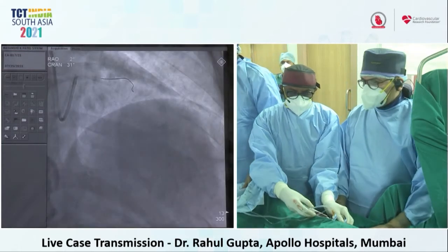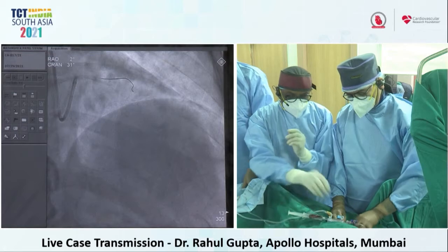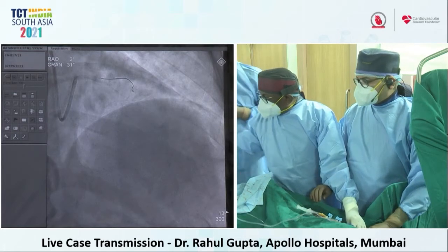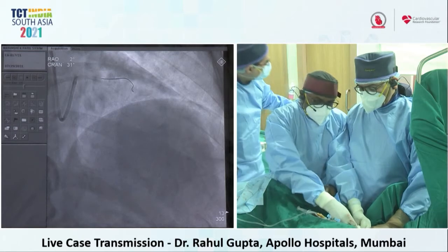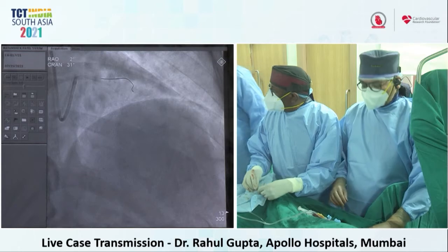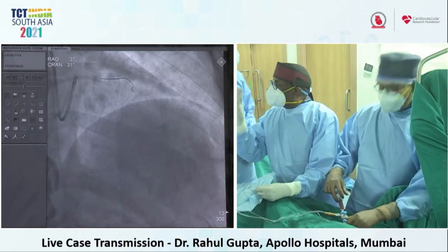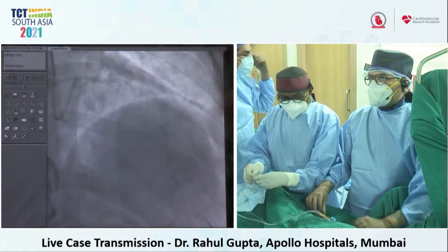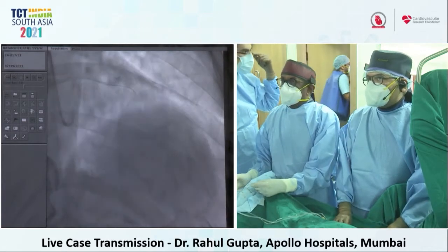Yeah, so the two comments I had was, one is that the radial artery size, Dr. Atul actually quoted for Indians as being 2.3, but in our data of thousands of patients, the average radial size in the Indian population that we've studied and published is 1.7 in females and 1.8 in males. The upper limit is usually around 2.